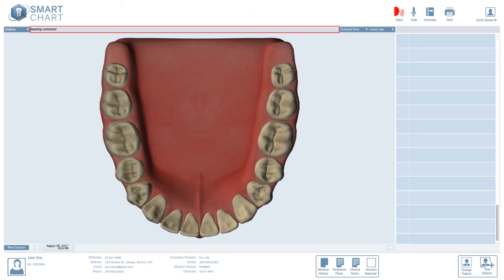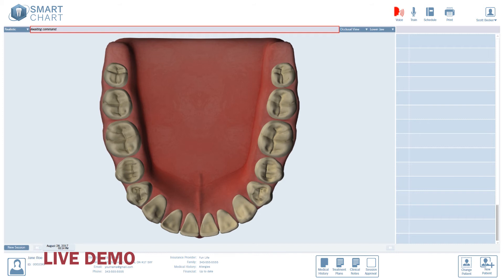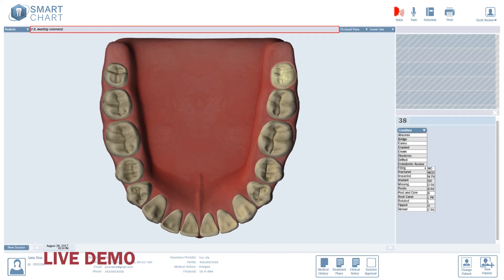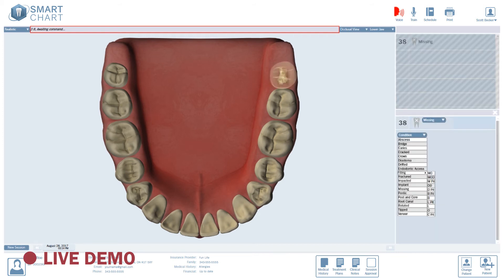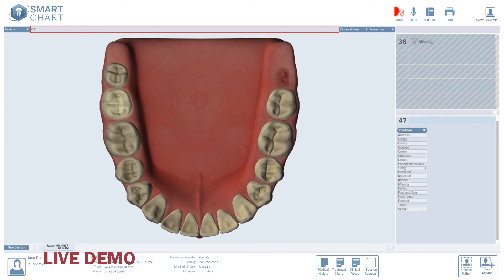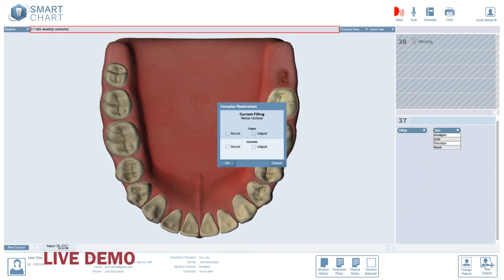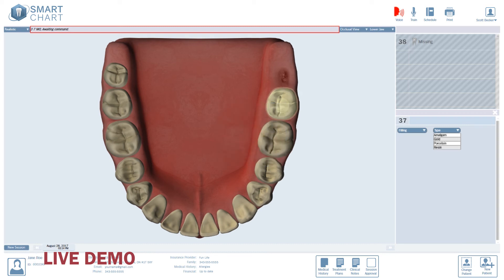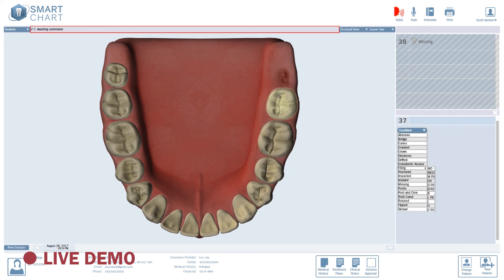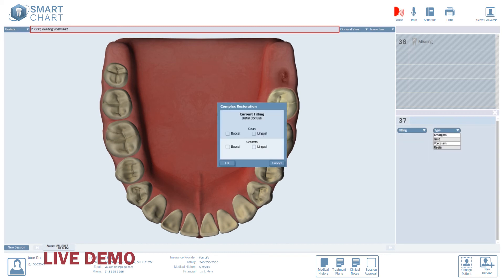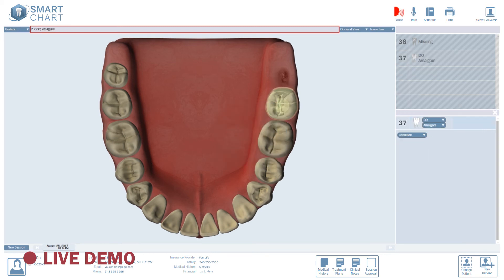Okay, fixing errors is easy and can be done by voice or with a mouse. In voice mode, let's make a few mistakes. 3. 8. Missing. 4. 7. Oops, I meant 3. 7. See? Back on track. M. O. Wrong. Should be on the other side. Cancel. D.O. Amalgam. Now it's right.